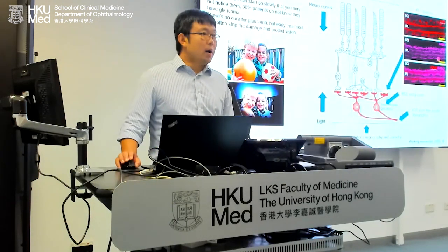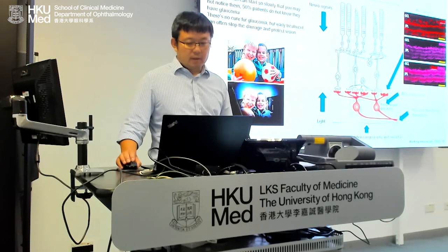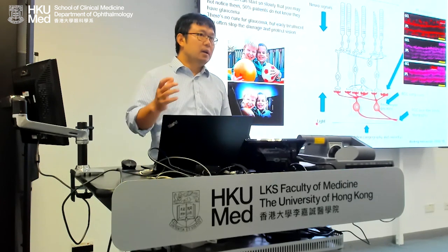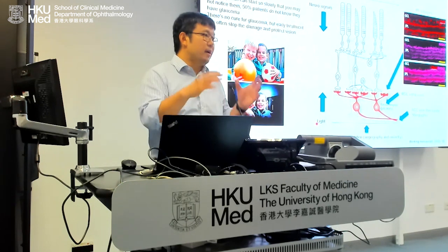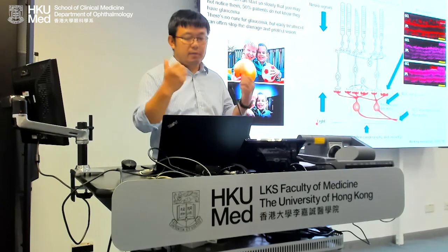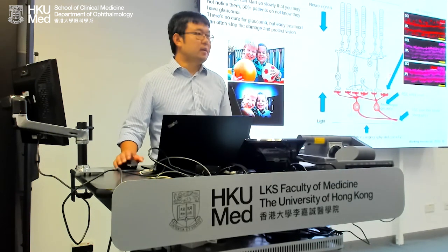So how are we doing the imaging around glaucoma? I'm using glaucoma as an example. This is the signal pathway for optical signal being converted to neural signals, and then from the neurons being synthesized by the bipolar and ganglion cells and then passed to the brain. We focus on the synaptic layers, we focus on the ganglion layers, we focus on the fiber bundles, and we focus on the oxygen consumption. So I will show case by case.